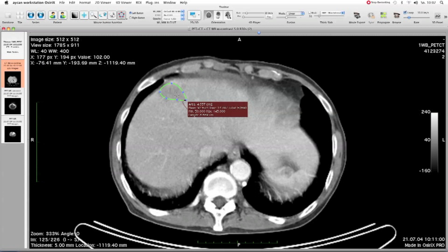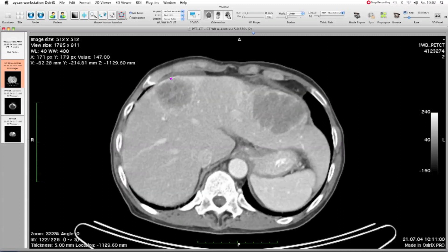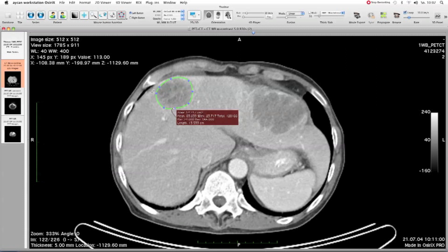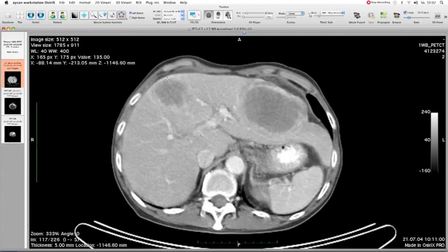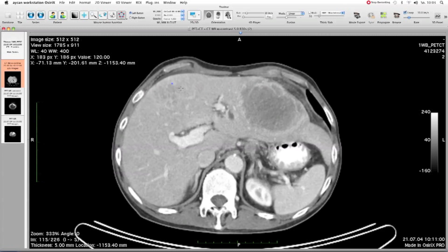I could do that on every single slice, but that may be a lot of work, so I let OsiriX assist me. I go down a couple of slices and do it again. The last click is a double-click, and if it doesn't fit we can move the points to adjust it. I go down a little bit more, do it again, and continue to the last slice where I can see the lesion.